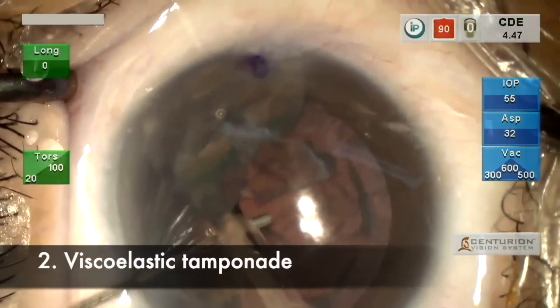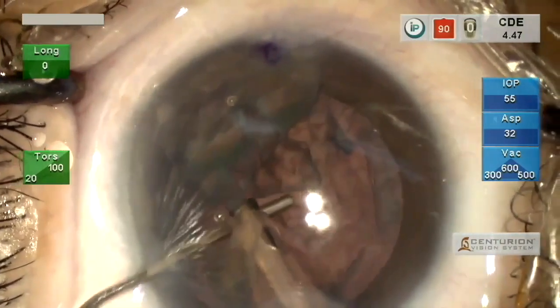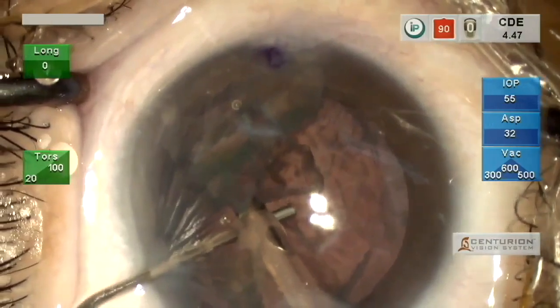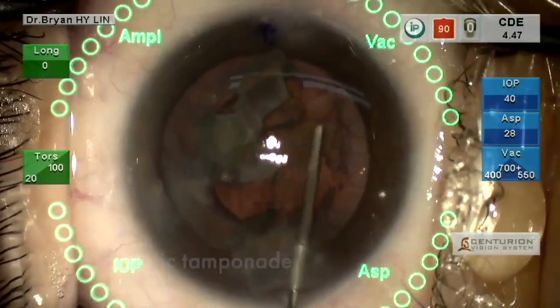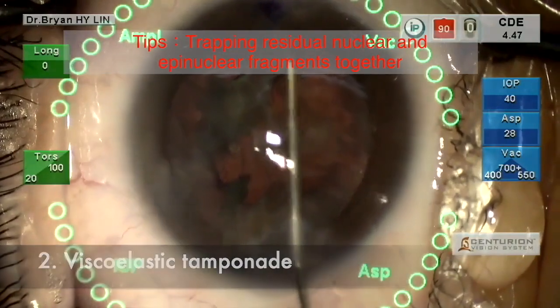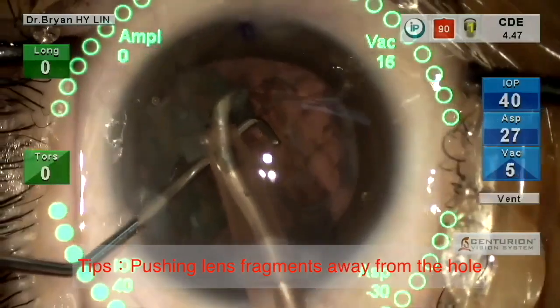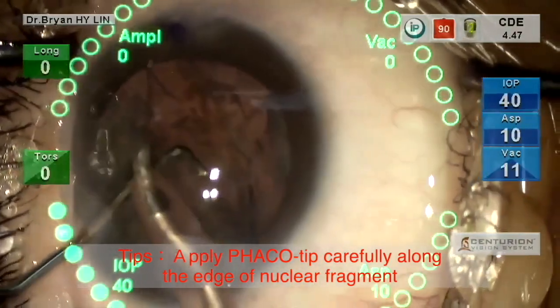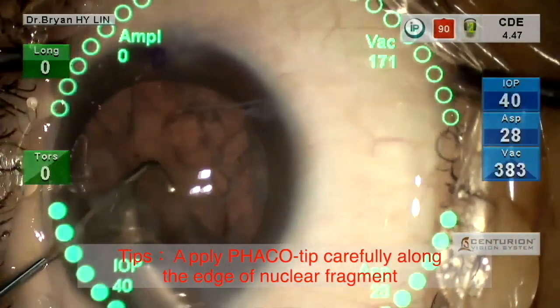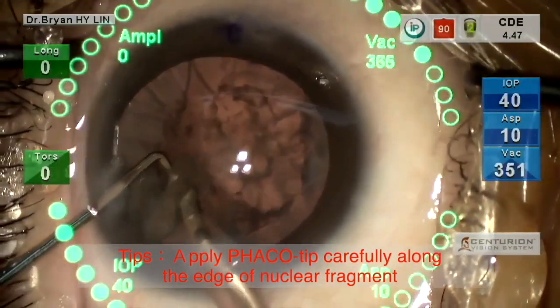Inject dispersive viscoelastic into the area of posterior capsule defect through the side port incision. Protect the tear from extension and tamponade vitreous from coming into the anterior chamber. Rescue. Fill the anterior chamber with dispersive viscoelastic, thereby trapping residual nuclear and epinuclear fragments together and pushing lens fragments away from the hole. Then apply the phaco tip carefully along the edge of the nuclear fragment. Use the chopper as an assistant to move the fragment toward the phaco tip. Here the residual nucleus is removed smoothly without vitreous incarceration.